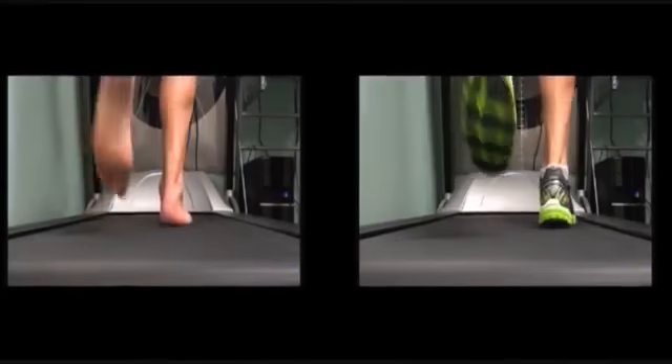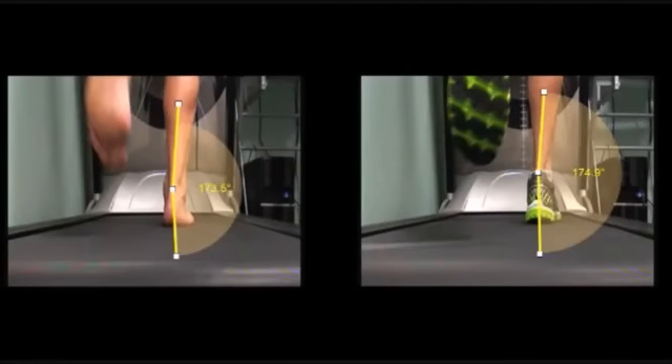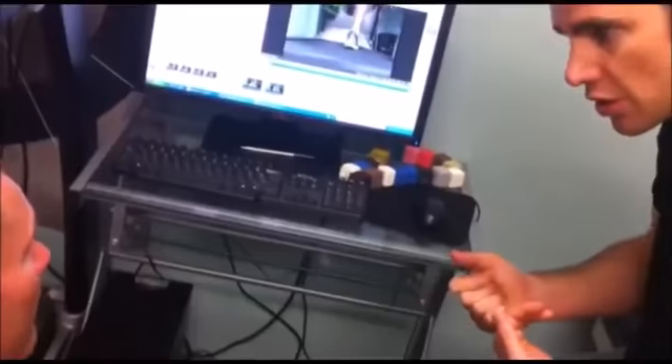Now let's take a look at the difference that a well fitted running shoe makes to the gait cycle. In the side by side view you can see that the overall pronation has been reduced by 1.4 degrees. This still sits outside what we would consider normal, as the foot still pronates 5.1 degrees. We can further customise this shoe by adding an inner sole that will help to control excess motions without overcorrecting the foot.